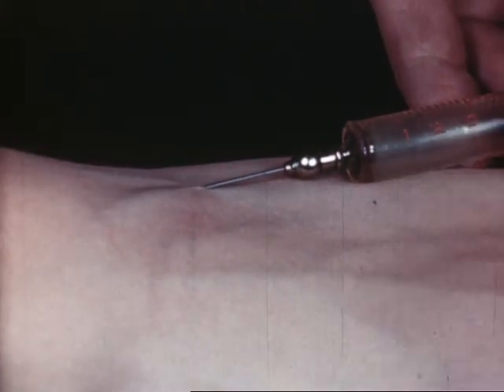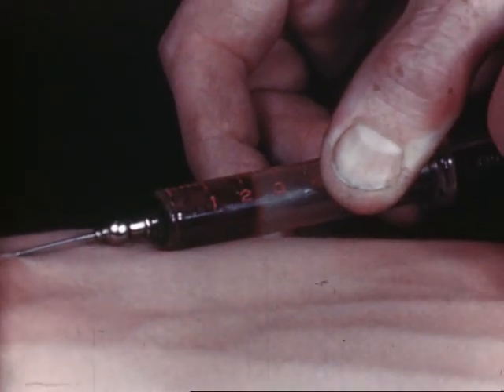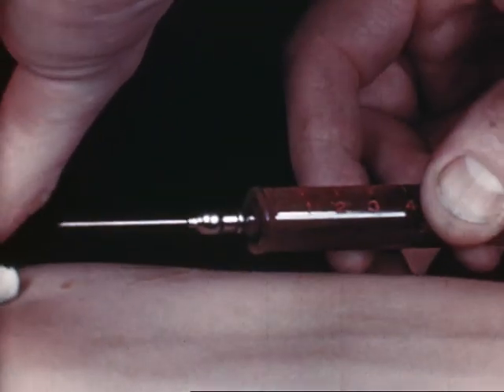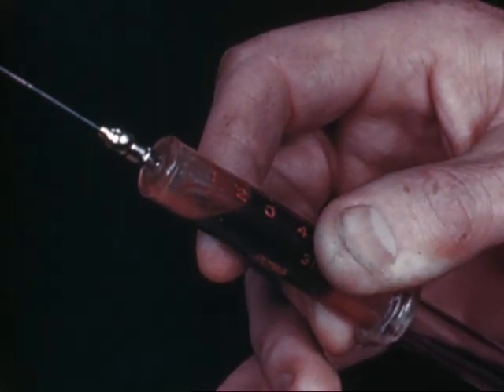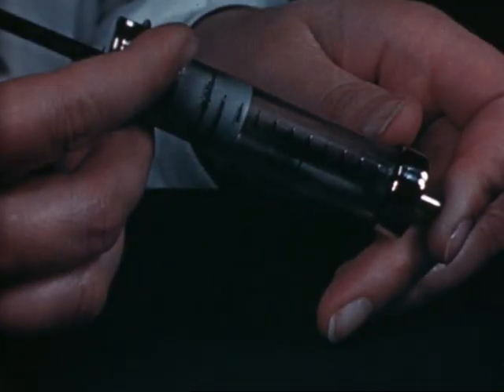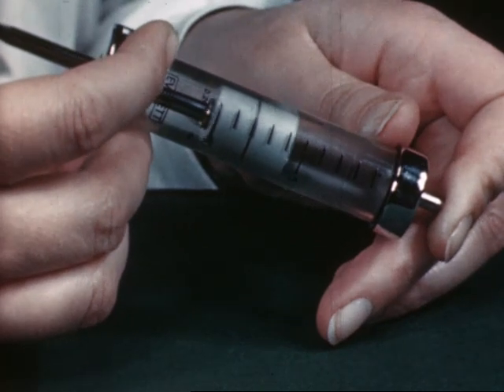This time the fault is a leaking syringe, which may only yield half the blood you want. This means having another go, and the patient won't like that. To avoid this, test your syringes periodically by pressure.